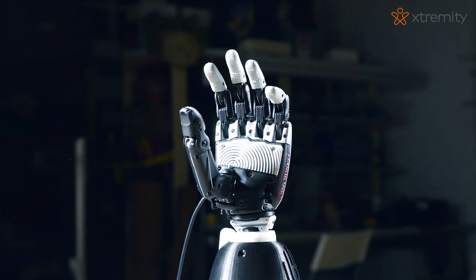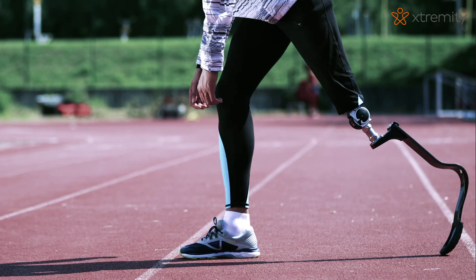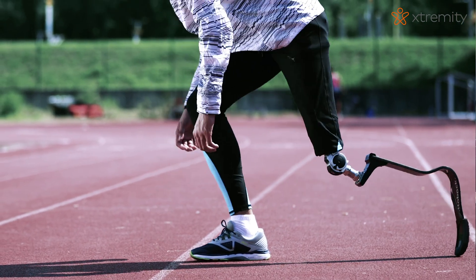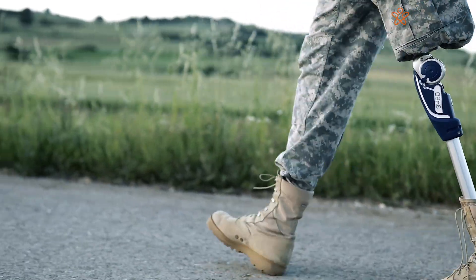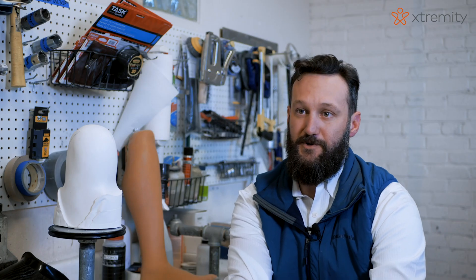All the new innovation is being put towards high-tech, expensive prosthetic componentry. If the socket isn't comfortable, you can't get any of the benefits out of a fancy fitting. It's the most important part, it's the second most important part, and it's the third most important part.